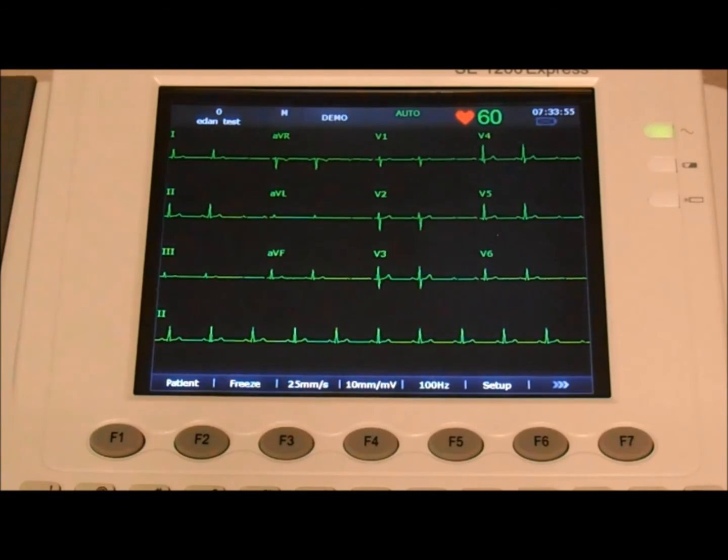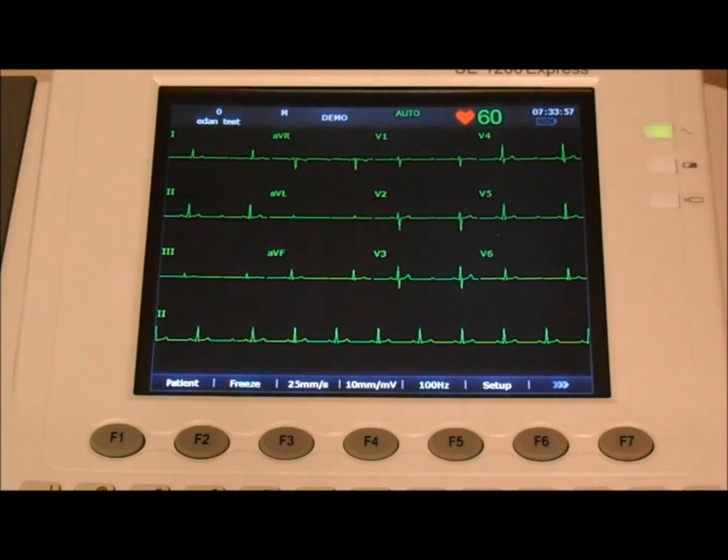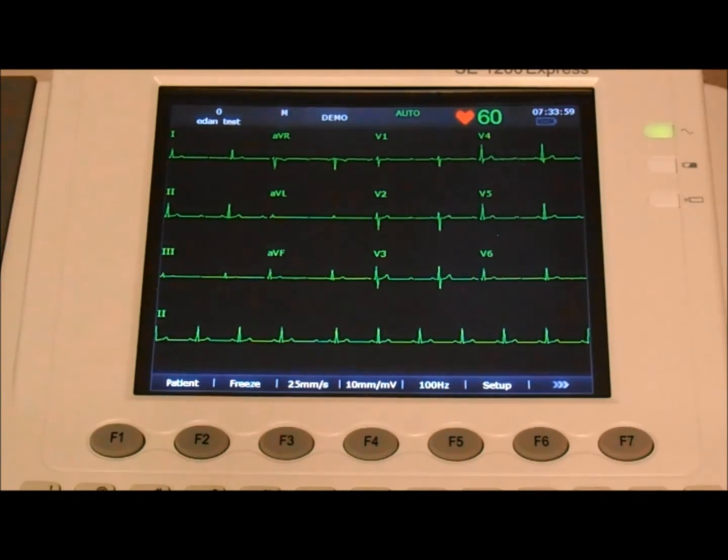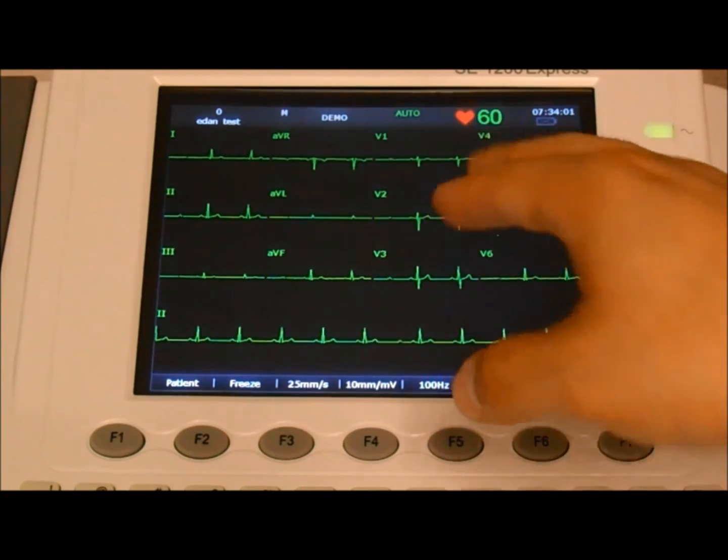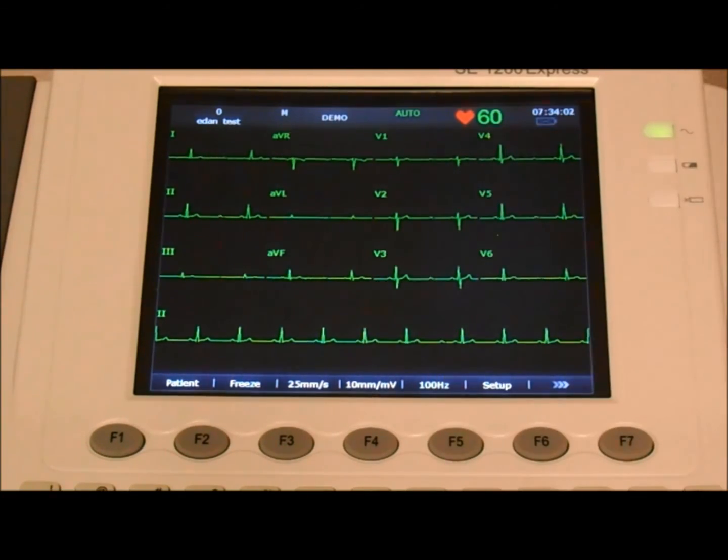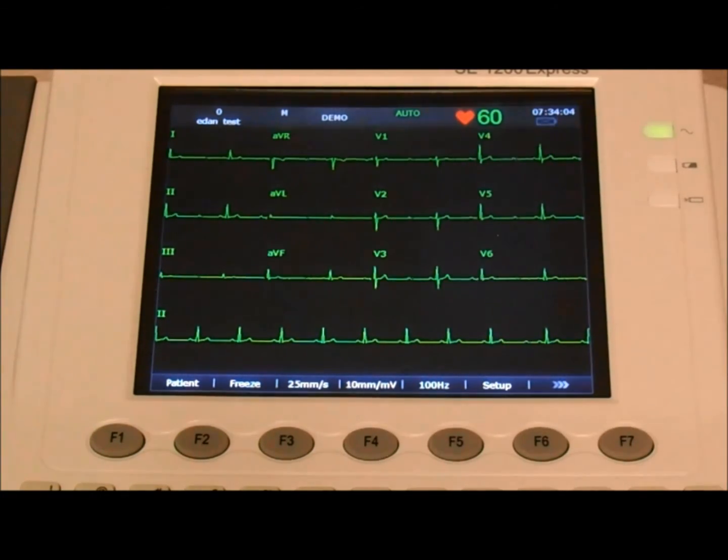Now to go from one patient to the other one, simply disconnect the patient, and once the leads are disconnected, the system will refresh and start a brand new patient session.